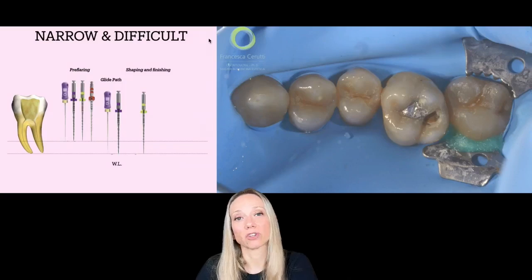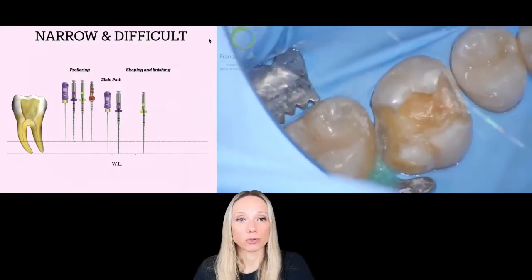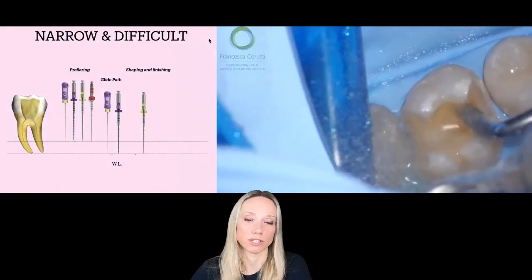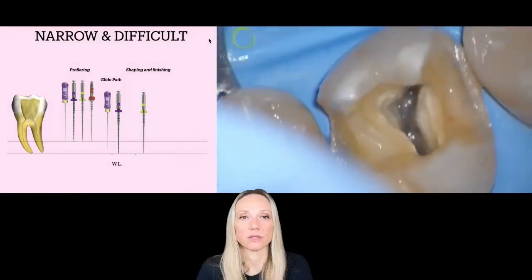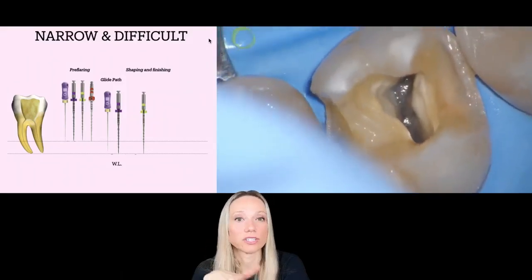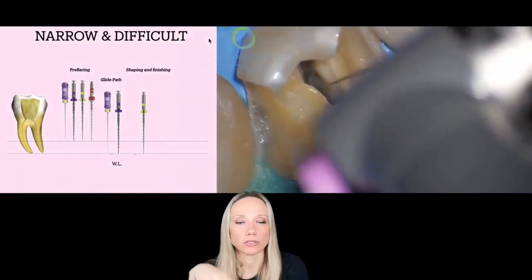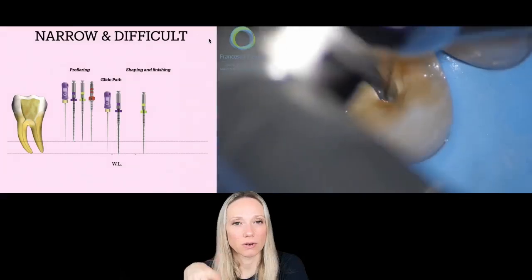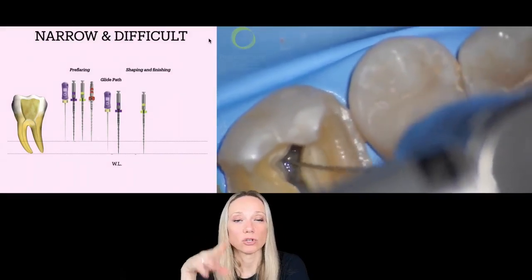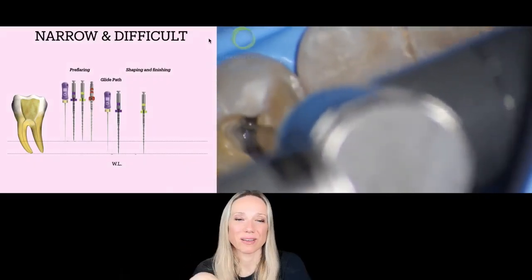Well, in this case, you have to be more careful and you have to do a little more job because you have to pre-flare coronally with all the sequence up to 2506. In this case, what's happening? It's happening that you remove all the pulp chamber roof, and then you start to see the openings of the root canals. You can use an orifice opener. I prefer to use ultrasonic tips just to work at the level of the orifice to remove the coronal interferences, and then with your files you just go in the coronal 2/3 and you just pre-flare them a little bit.